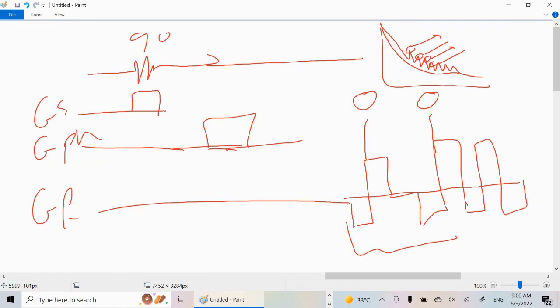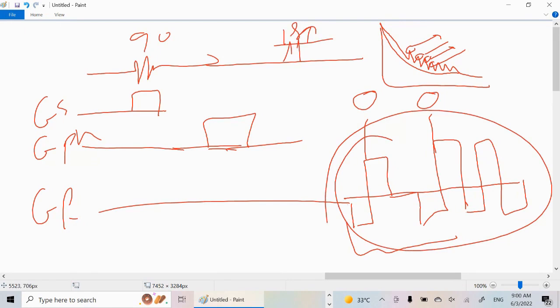Echoplanar imaging can be used in the spin echo sequence, meaning you use 90 and 180 degrees, and after 180, you use a set of gradients to achieve the same concept and work in imaging. Echoplanar imaging requires high magnetic field machines, and the gradients are significantly stressed during imaging, which slightly affects the artifacts. This is the echoplanar imaging that I am referring to.